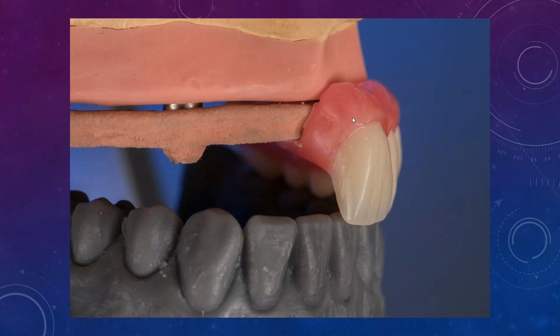Now, the only little downside that you have is that because this tooth is so highly wear-resistant, it actually has a lot of ceramic in it. Well, when you have a high percentage of ceramic in something, it's more fracture prone, right?